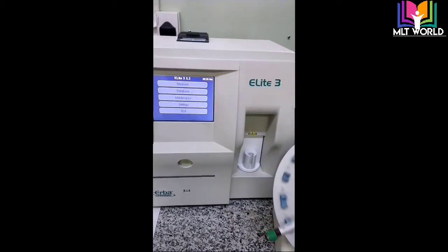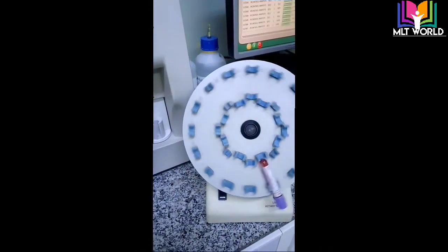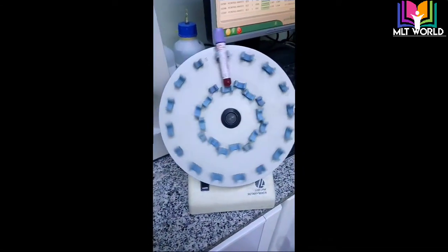I hope you liked my review of the Erba Elite 3. Thank you so much. Now at the end I will show you how to run one sample. I have placed a sample on the rotor for two minutes, so I will now run this sample.